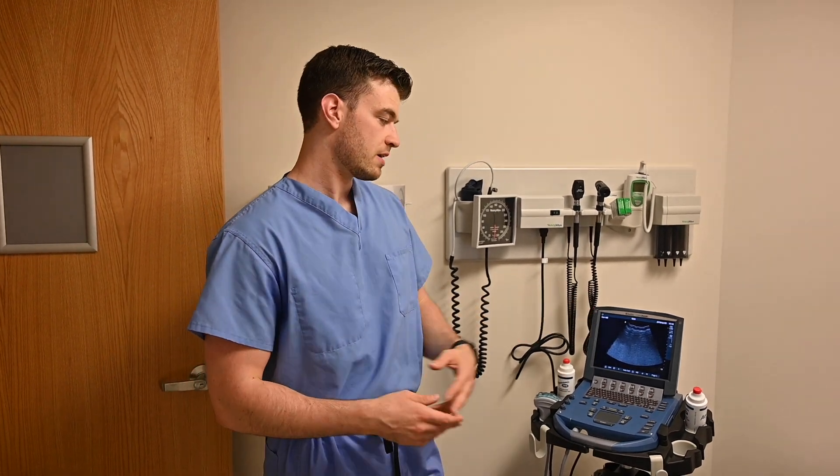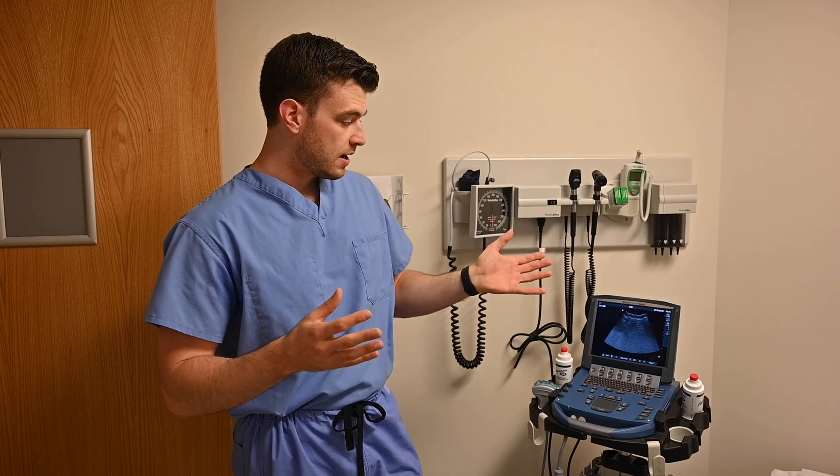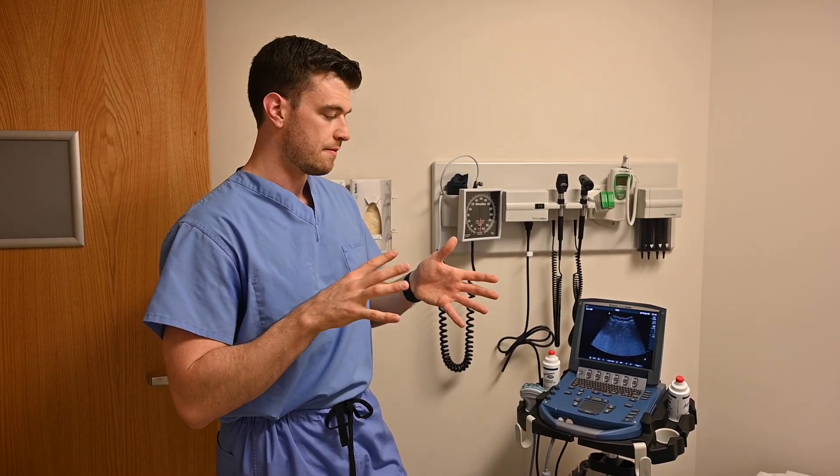So what is ultrasound? Basically we're using sound waves to get a look inside the body. You're looking at a gray snowstorm on screen, and these are sound waves penetrating into a substance. They won't pass through air and they won't pass through solids — if you're on bone you'll just see artifact, and if you're over air you also won't see anything. The waves need a solid medium like tissue or fluid. In ultrasound we use a lot of windows; the liver, for example, is a viewing window, and a stomach full of liquid could be a partial viewing window.